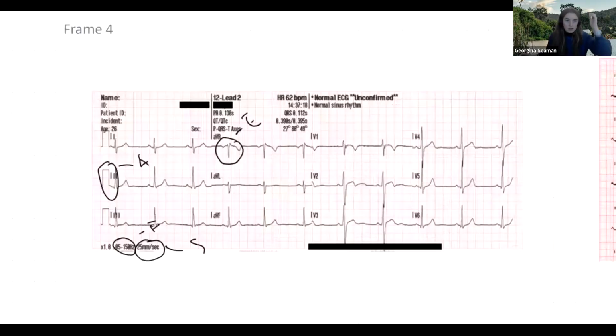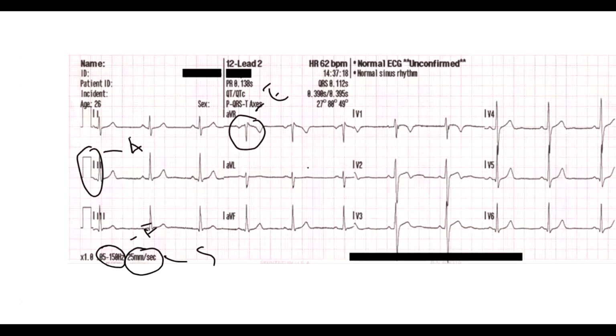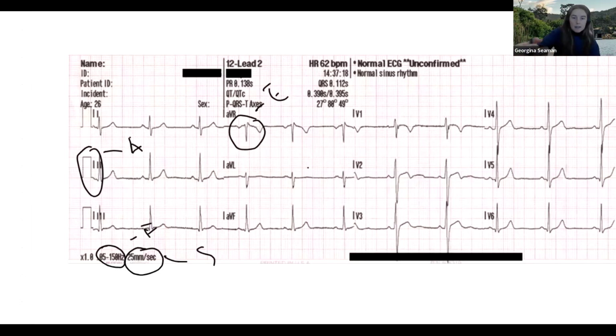Can we check that our electrodes are in the right spot? What are the two leads we need to check are in the same direction? V1 and V6. Close. V6 is correct, and lead 1, yes, from Alison. Okay, so this is also our E.